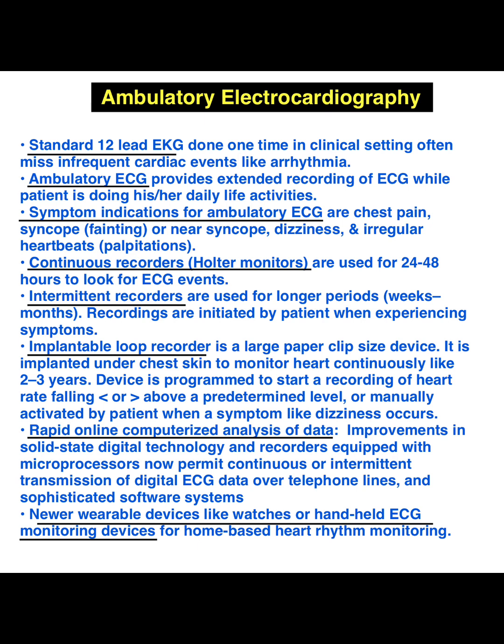This slide is about discussion for ambulatory electrocardiography. Standard 12 lead EKG is done one time in a clinical setting and often misses infrequent cardiac events like arrhythmias.